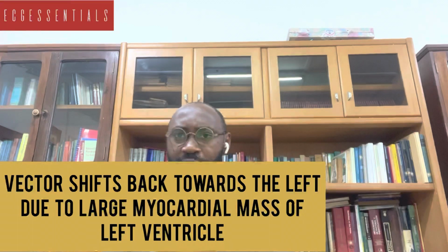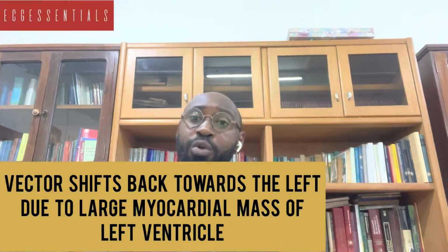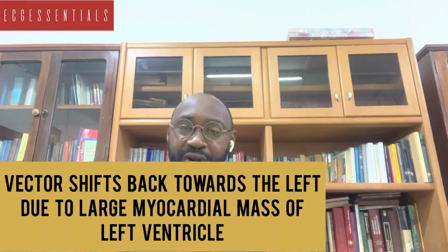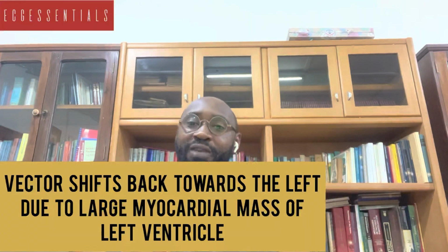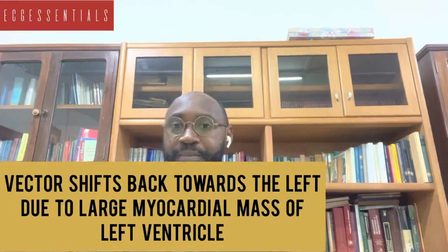And because the left ventricle, we have said, forms the vast majority of the myocardium, the angle of orientation of the overall vector of depolarization now shifts again towards the left side. So earlier, in the interventricular septum, it was moving from the left towards the right. Now, because of the substance of the left ventricle, it shifts again towards the left side.